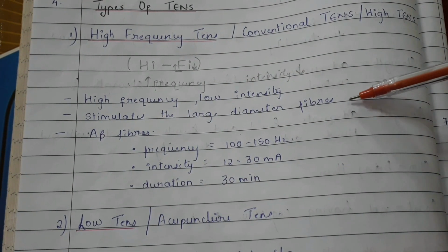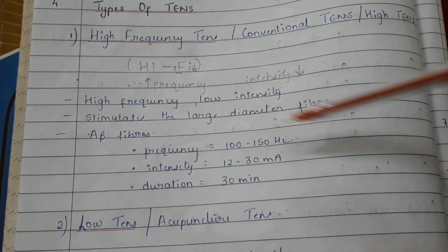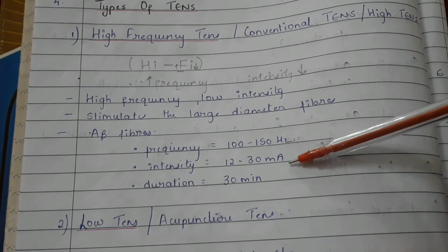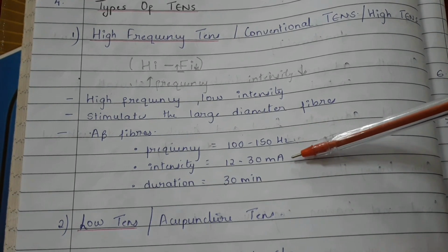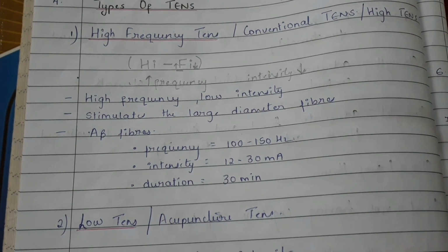It stimulates the large diameter fibers, that is the A beta fibers. Frequency used is 100 to 150 Hz. Intensity is about 12 to 30 milliampere and duration is around 30 minutes.